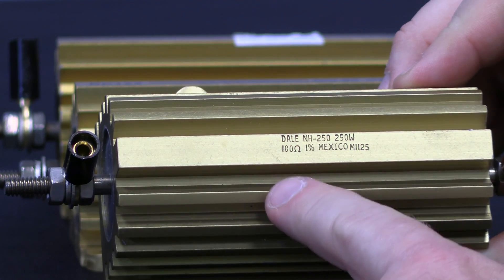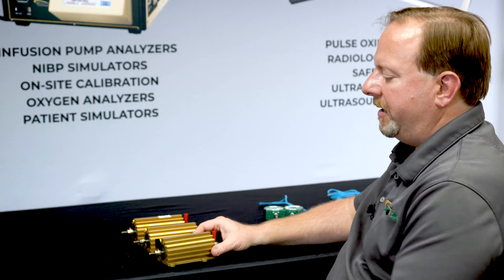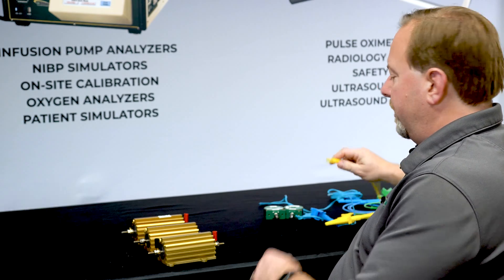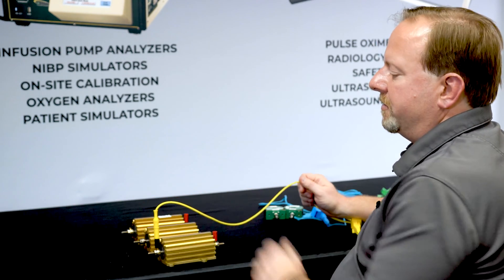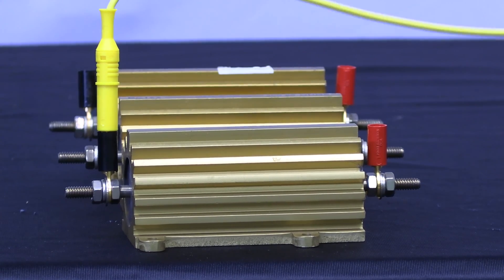This particular one is a 100 ohm load, and it also has the optional banana adapters that are attached to the load. The banana adapters allow you to easily plug in your electrosurgical cables that come with the accessory kits for the ESU 2050 or 2050P.